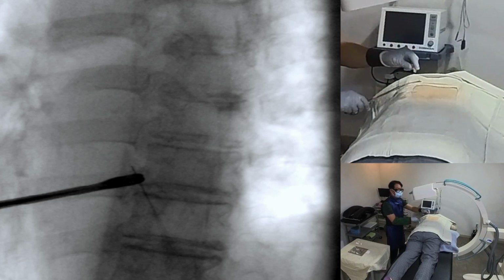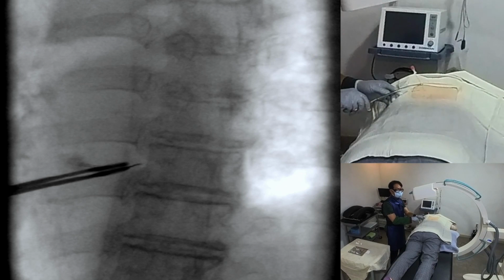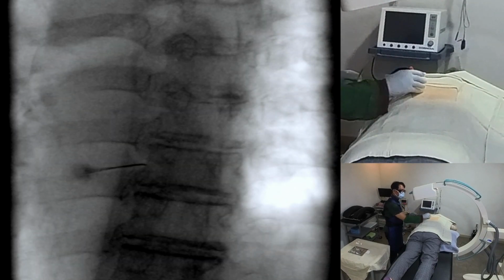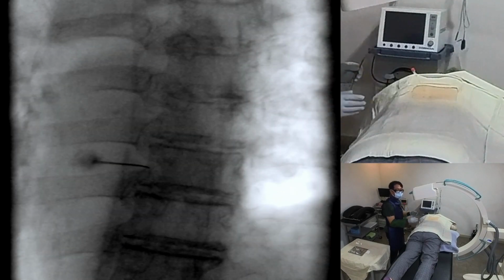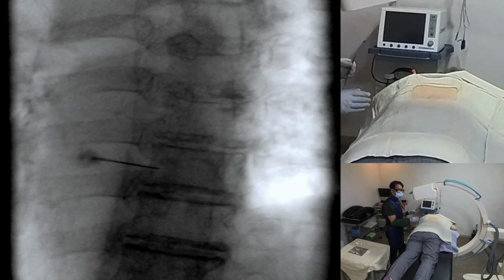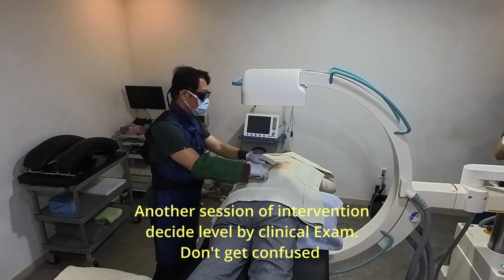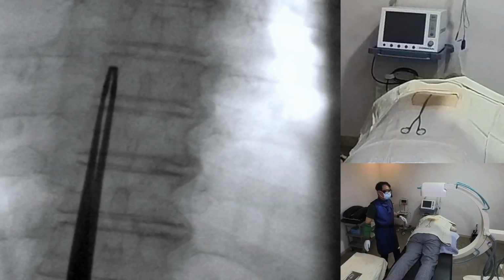Third, there are neighboring vital structures such as the pleura and lung. The proximity of these structures to the thoracic spine increases the risk of pleural puncture or pneumothorax during the injection. To determine the target level, I asked the patient to mark the painful area and then trace along the rib when there is paraspinal or lateral chest pain.